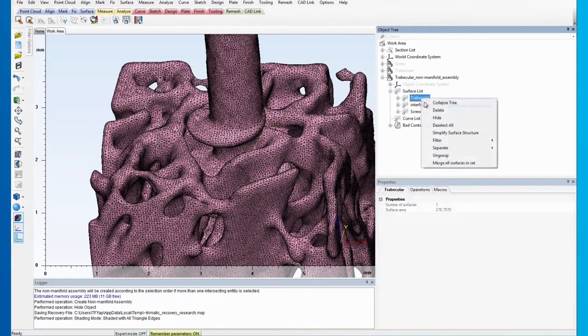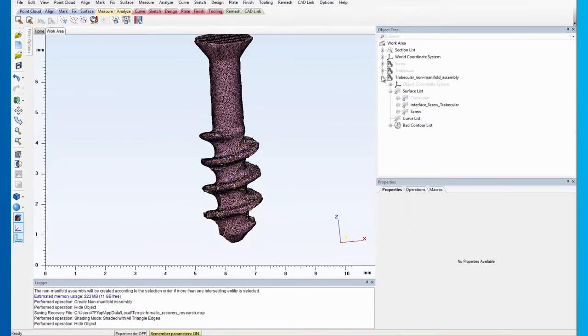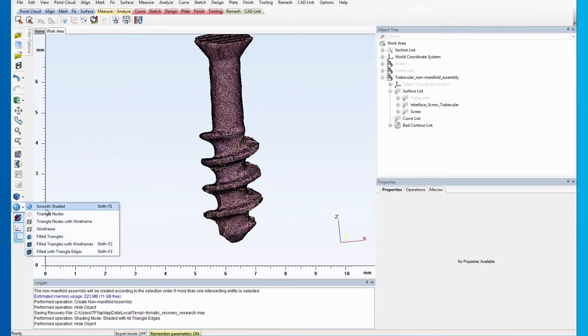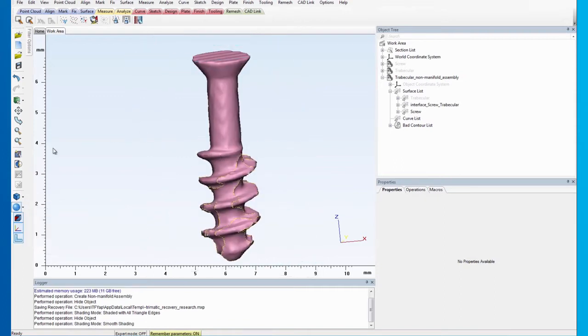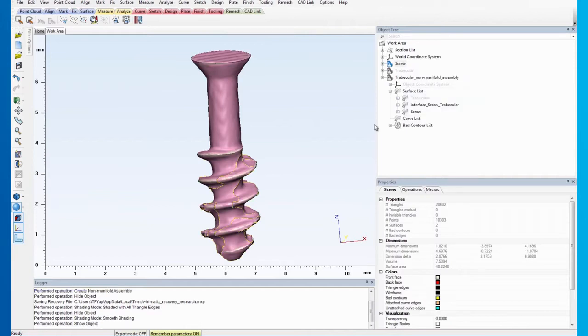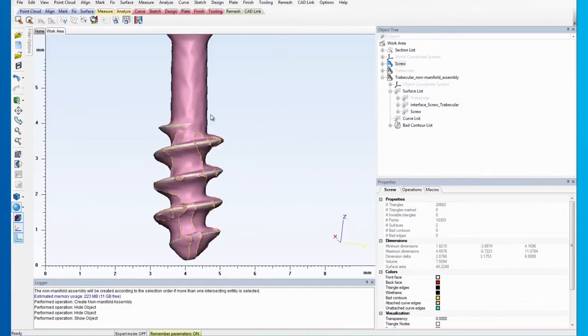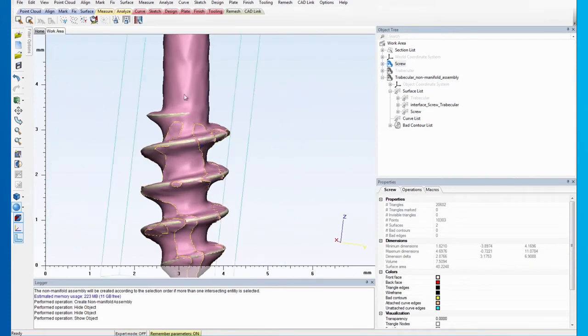Hide the trabecular surface set and visually compare the screw portion of the assembly to the original screw part. There is a noticeable difference between the two. So, the next thing we need to do is improve the accuracy of the screw portion of the assembly.